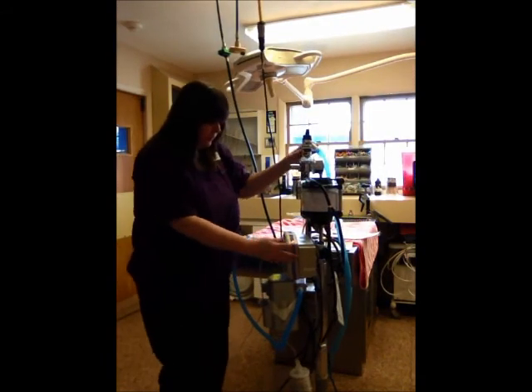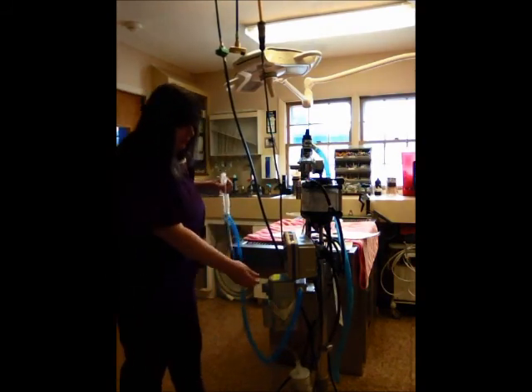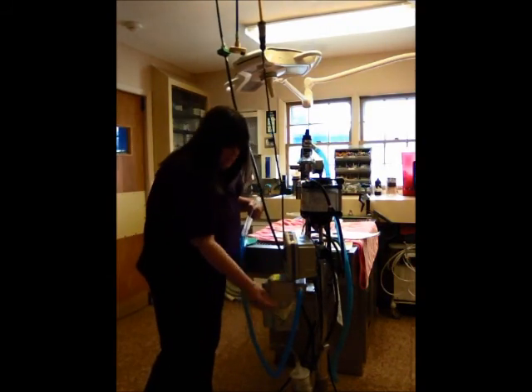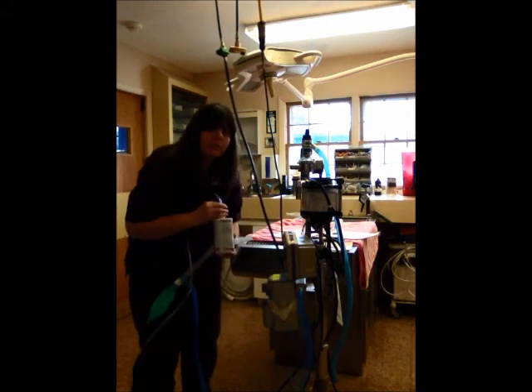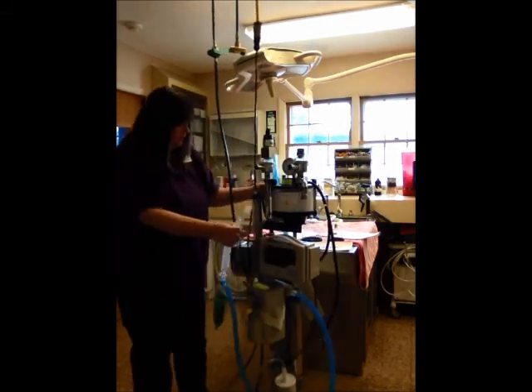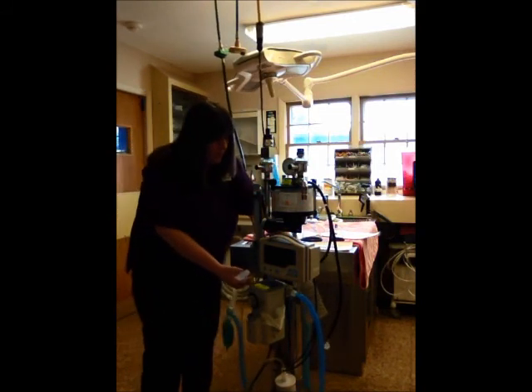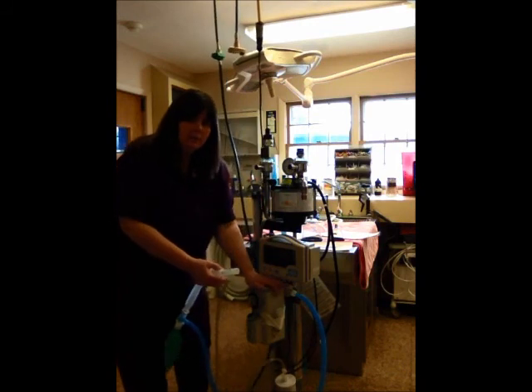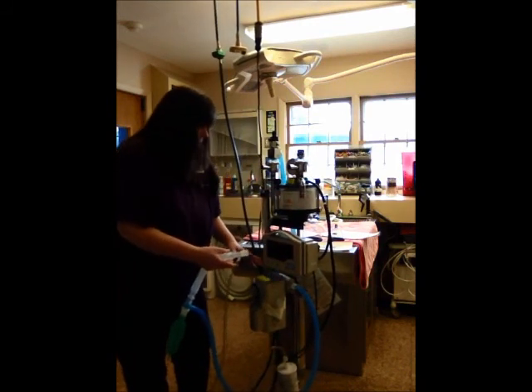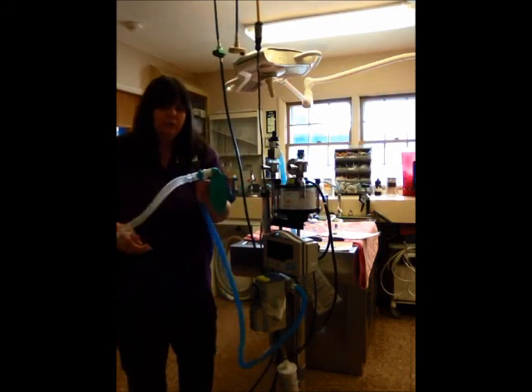So now for the non-rebreather tubes, the non-rebreather gets hooked up directly to the vaporizer and directly to the anesthesia absorbing canisters. The oxygen is going to come in the same way it did from the bottom of the flow meter. It's going to leave the top, travel through and enter the vaporizer, picking up anesthetic gas with oxygen. However, this time it's going to go directly into the inhalational tube.